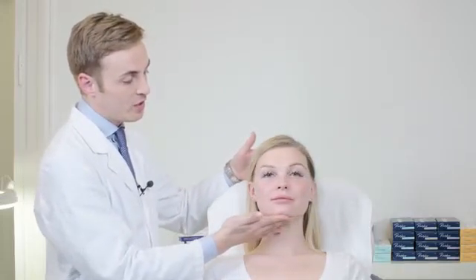To fulfill Cassandra's request for natural enhancement of the cheeks, we injected 2 ml of Restylane Lift into her cheeks, which is an amount usually needed for patients with firm skin, good tissue coverage, and pronounced facial features. As you can see, the amount does not over-project the cheek, but rather gives a very natural looking ogee curve and lid-cheek junction, as well as a transition from the upper to the lower cheek.